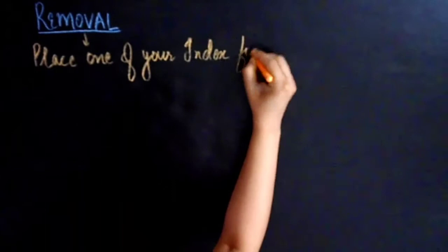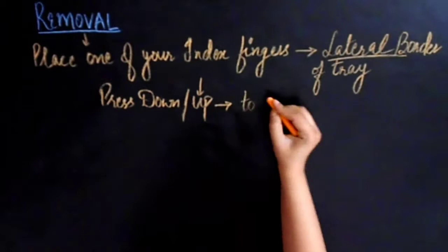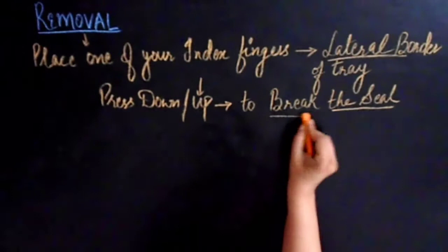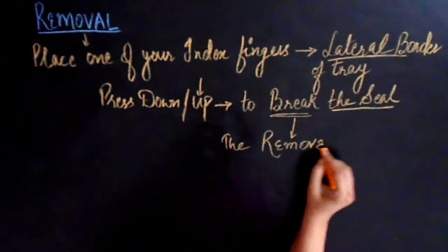After the alginate has set, place one of your index fingers along the lateral border of the tray and press down for the upper impression or up for the lower impression in order to break the seal formed by the set material. Once the seal is broken, carefully remove the tray from patient's mouth. Gently pull the tray straight down for upper impression or up for lower impression away from the teeth.